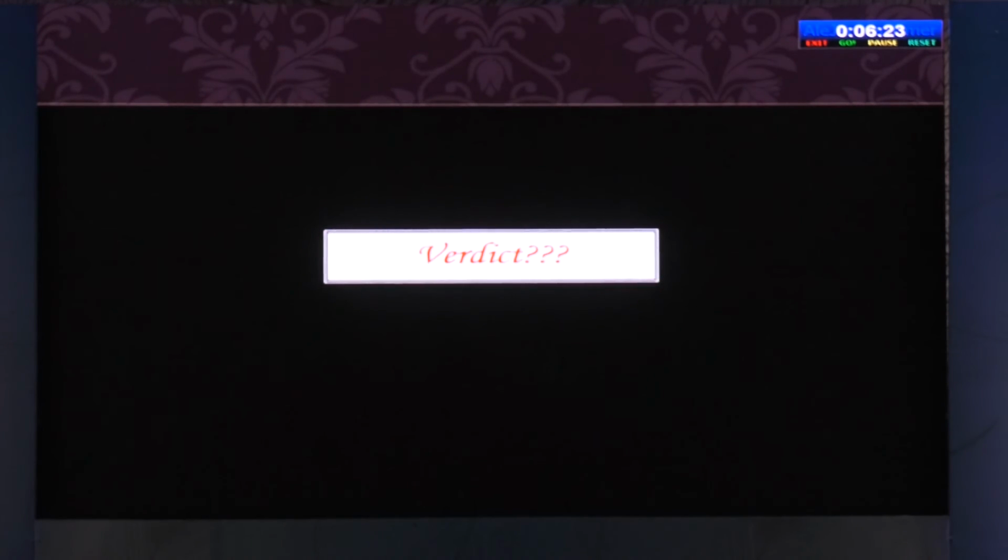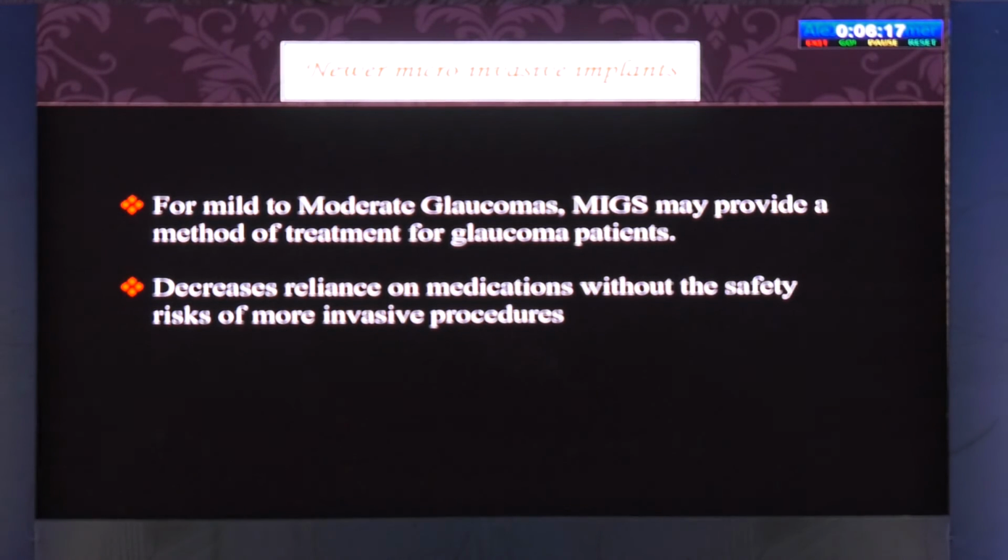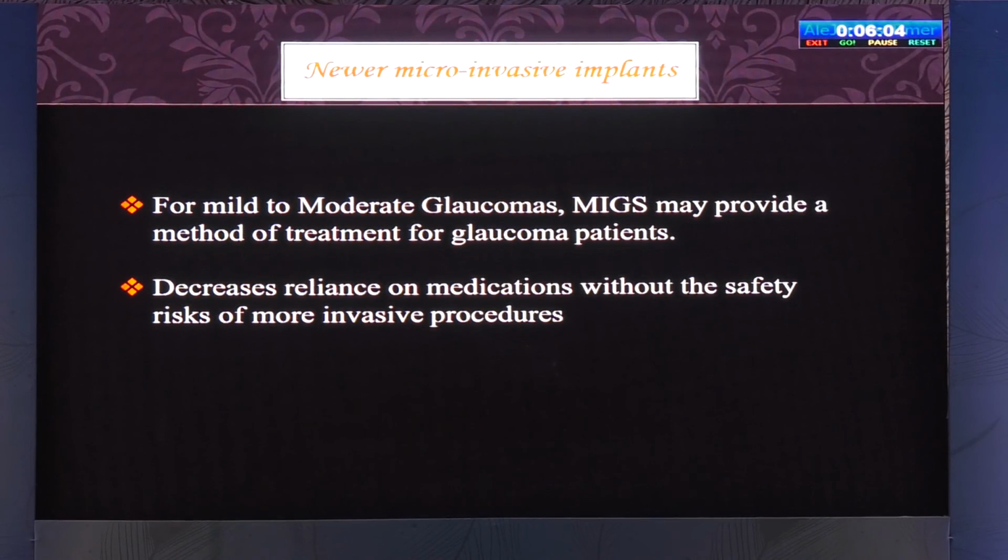So what's the verdict? Is it really overrated? I think no. It is of real benefit where the traditional, conventional methodology doesn't work. There are newer microinvasive implants which we've already seen. They can be used for mild to moderate glaucomas, and they definitely decrease reliance on medications without the safety risks of more invasive procedures like AGV.